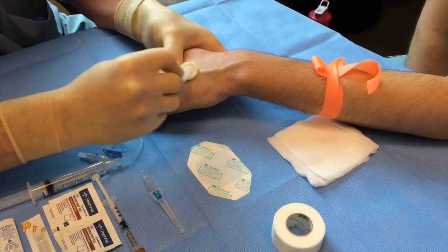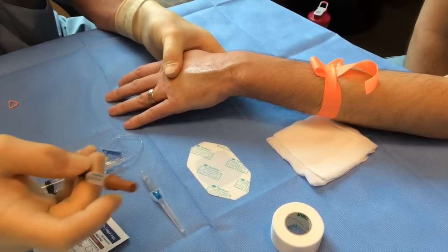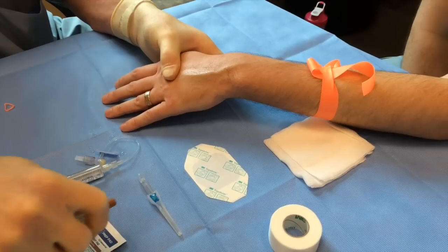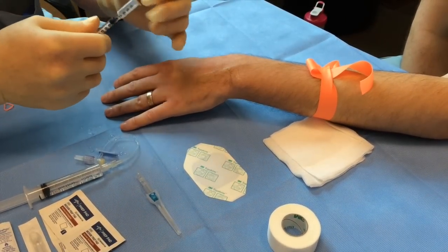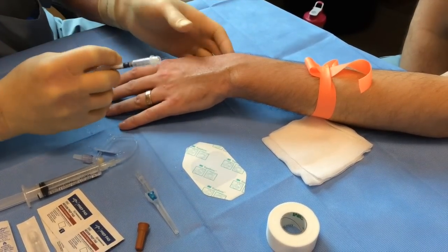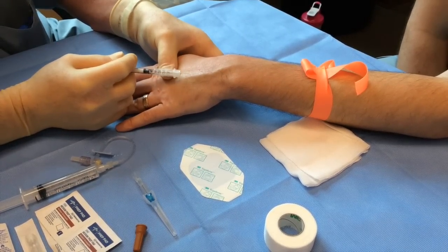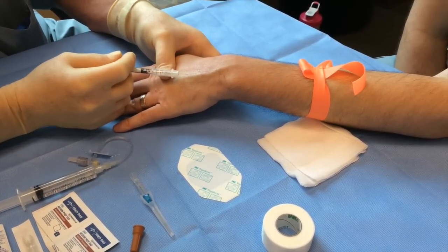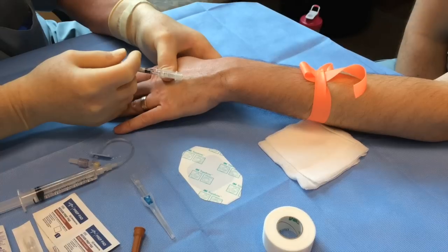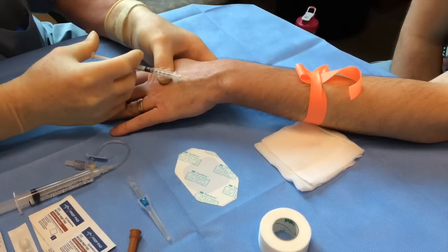Here's my prep. I've got counter traction with my non-operative hand. This is a 28 gauge needle on a TB syringe. Counter traction with my non-operative hand, and I brace against my non-operative hand as I approach the skin — traction away from the vessel. Here's a pinch, and you're in the dermis.